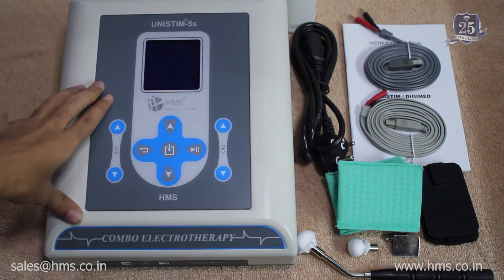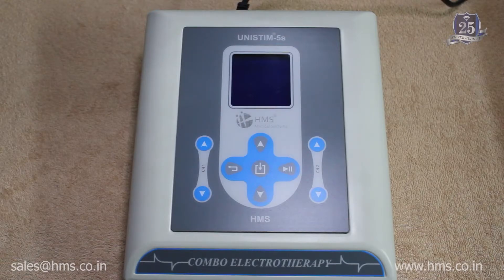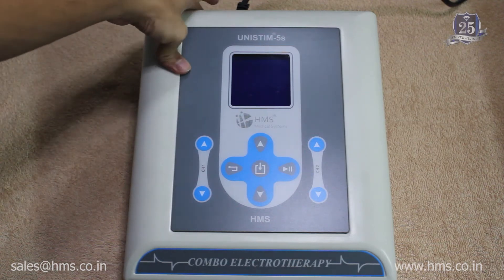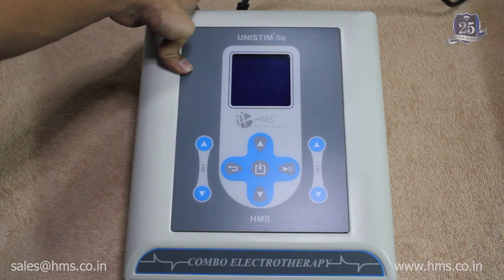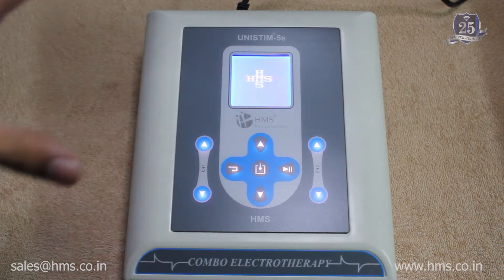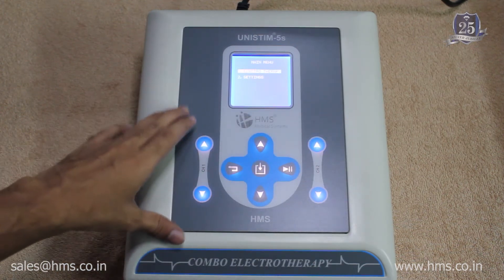Now we'll get into the functions of the machine and its unique features. Switching on the machine is very simple — you just plug in the power cable to the back, and there will be a power button near the plug point. Just switch it on, and the machine is in the on state. First, I'll walk you through the functionalities of the key switches.